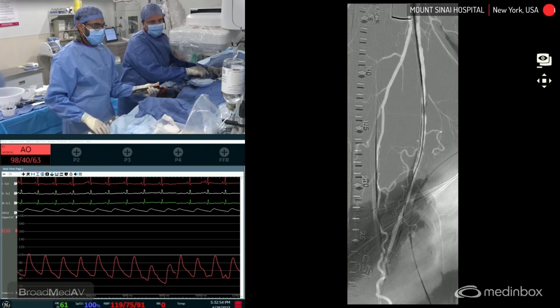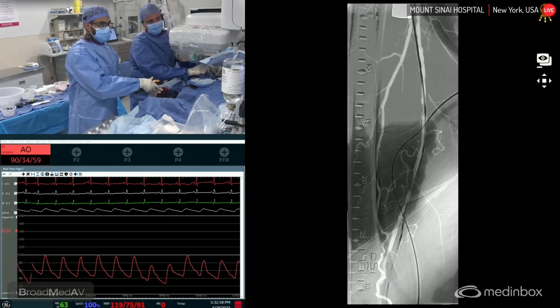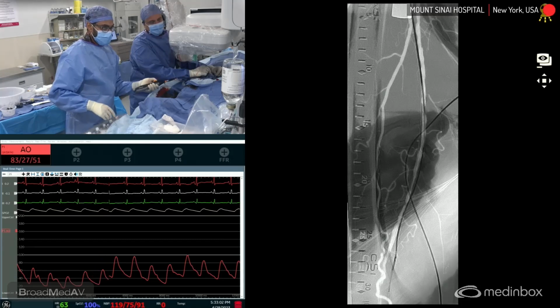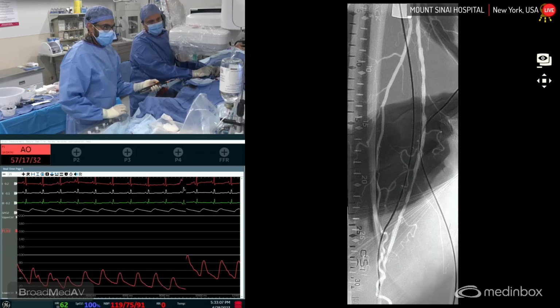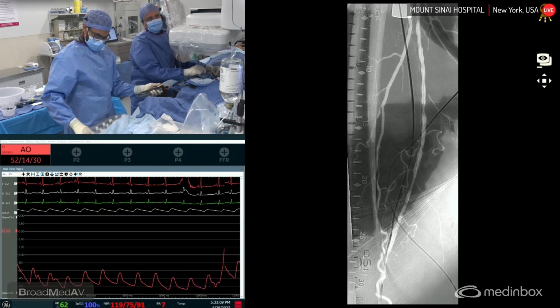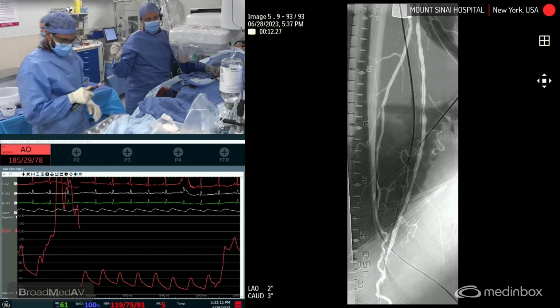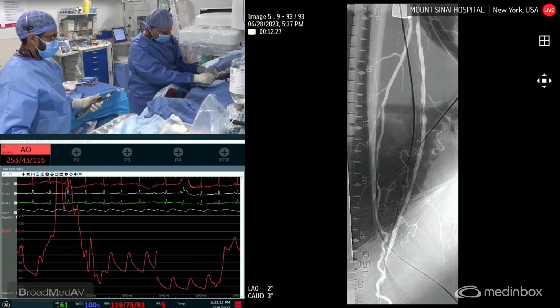Off. And then I'm going to go down distal past the CSI. I'm going to go right about here. It's okay. Come off roadmap. On, please. Stay there. Oh, okay, it's okay. Off. So I'm going to come back up again. I'm going to have to repeat my roadmap since we moved here. And then I'm going to go with the lateral cut.